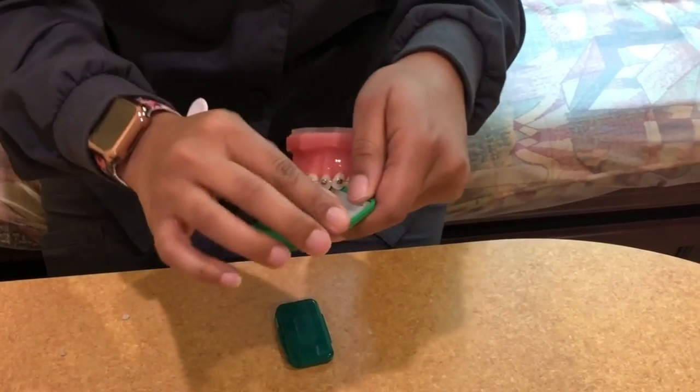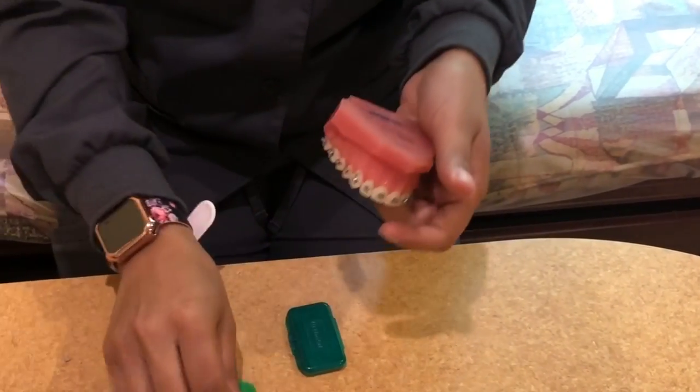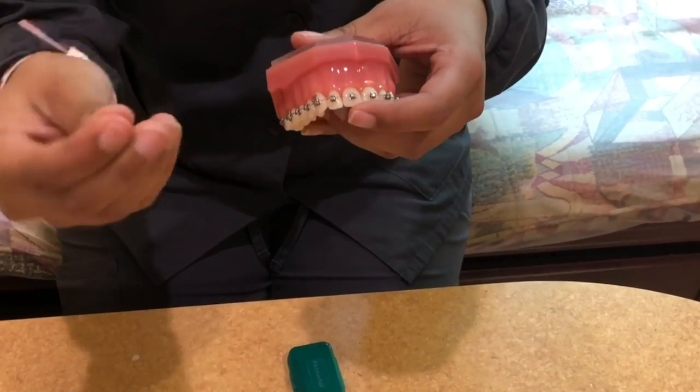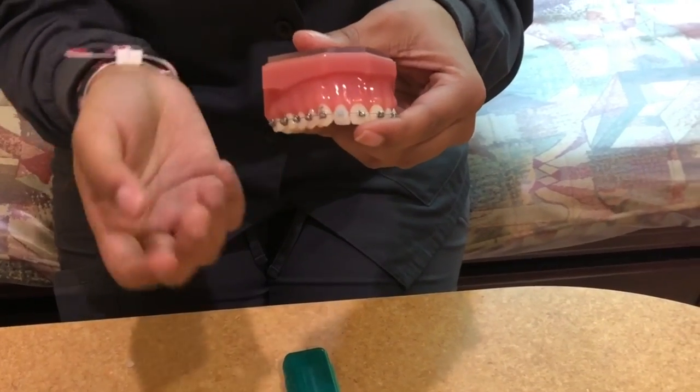Just pinch off a piece of that wax, roll it between your fingers to get it into a little ball, and then place it directly on any brace that is giving you any problems.